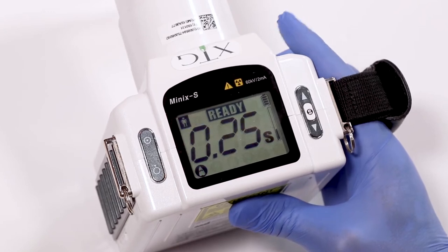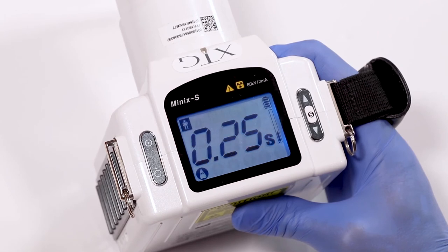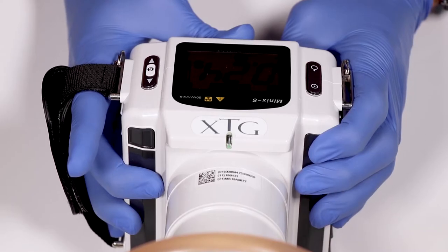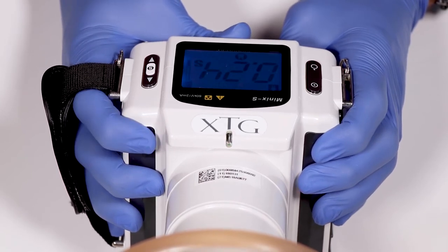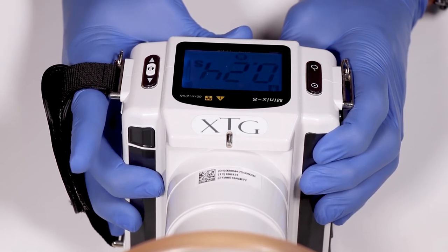Exposing an X-ray. XTG has a two-step exposure button that has a safety that unlocks for 5 seconds. To unlock, just press and release the button. To take an X-ray, you will press and hold the exposure button until the system completes the series of beeps.